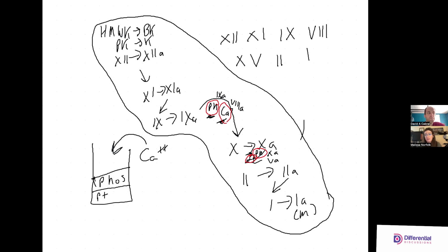That's it as far as APTT. Reference ranges and stuff like that should be determined by each laboratory, but mid 30 seconds ish, right? Okay. So we'll get rid of this and move on to the PT. It's a shame we did all that cool drawing. We don't want to confuse people though, I guess.